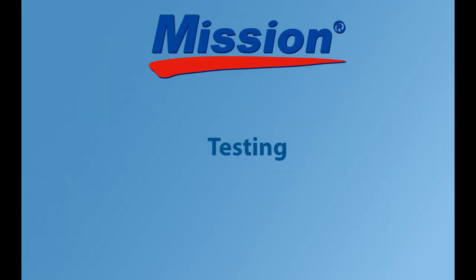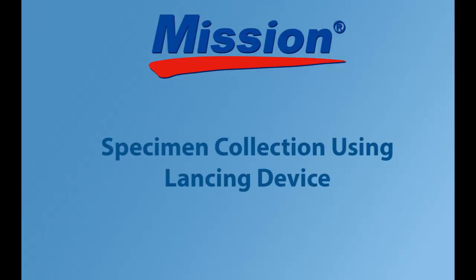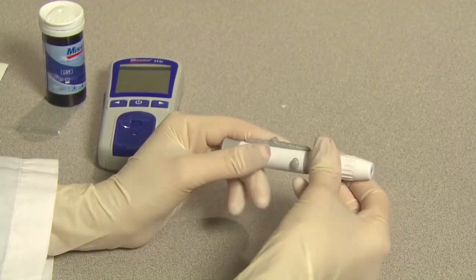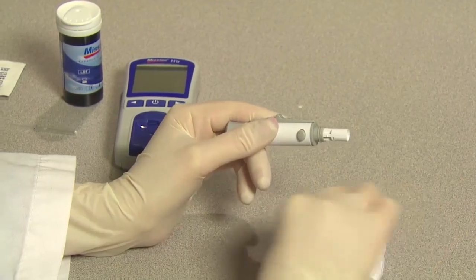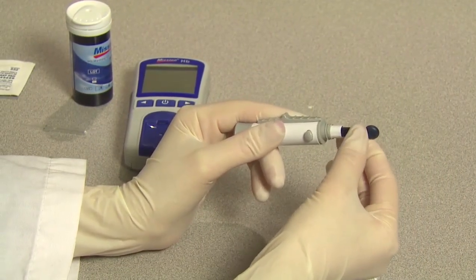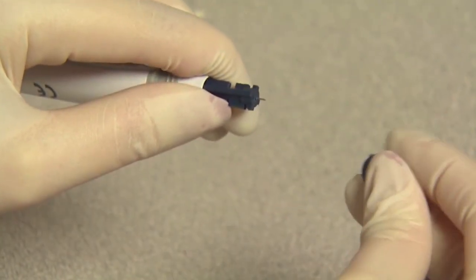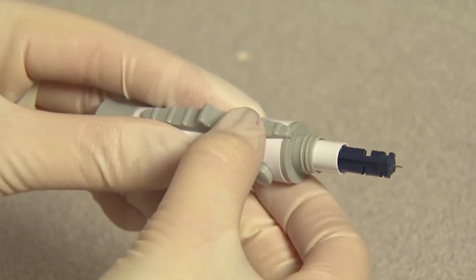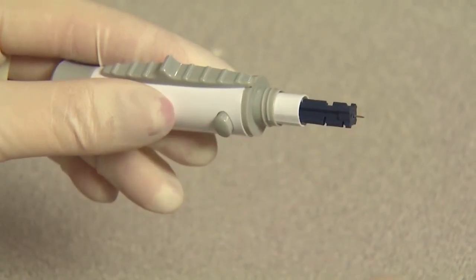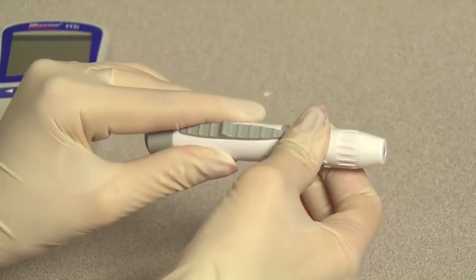Testing. In this section, we will show the testing procedure in a professional environment. Specimen collection using a lancing device. Unscrew the lancing device cover from the body of the lancing device. Insert a sterile lancet into the lancet holder and push it until the lancet comes to a complete stop. Hold the lancet firmly in the lancet holder and twist the safety tab of the lancet until it loosens, then pull the safety tab off of the lancet. Carefully screw the cover back onto the lancing device. Avoid contact with the exposed needle.